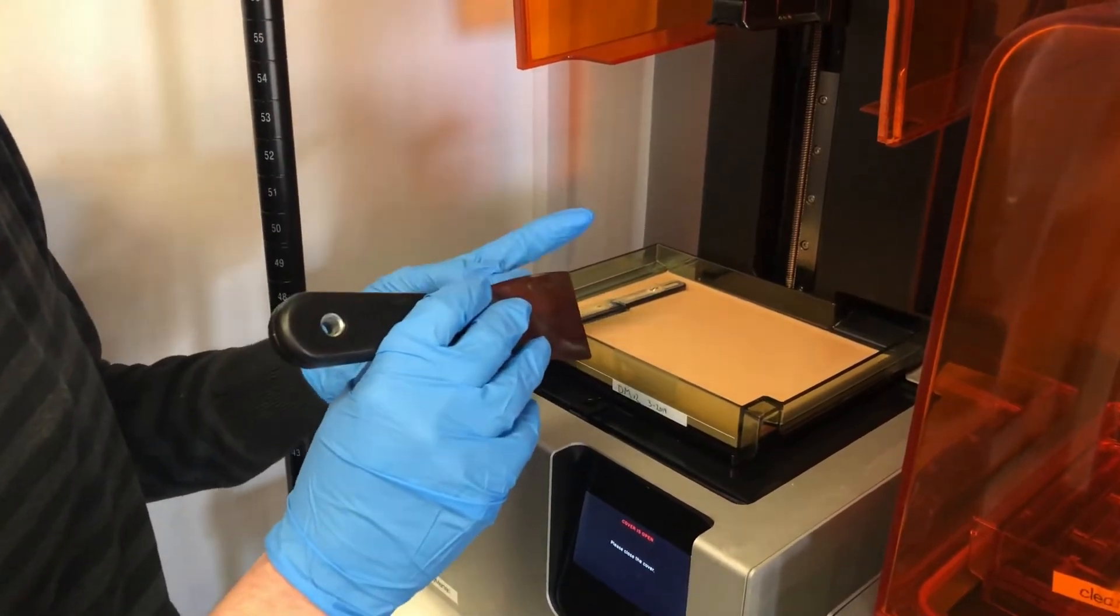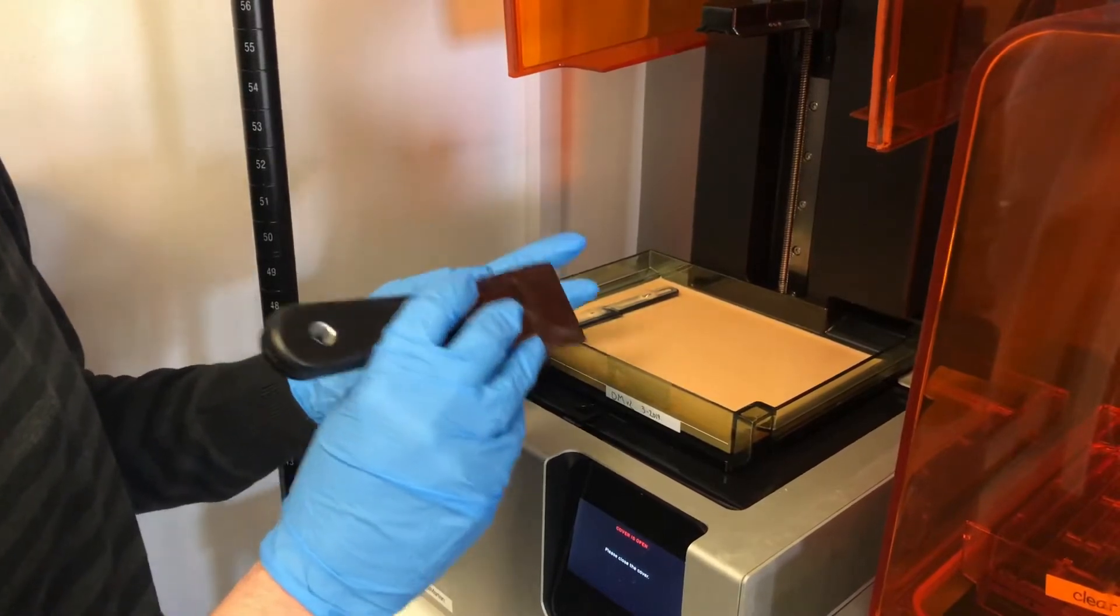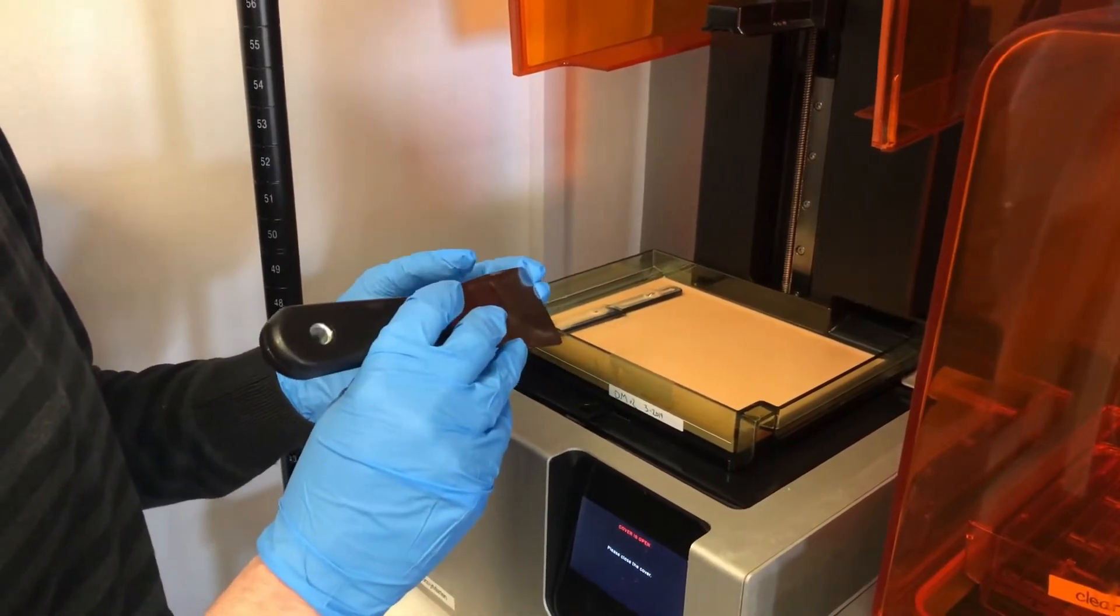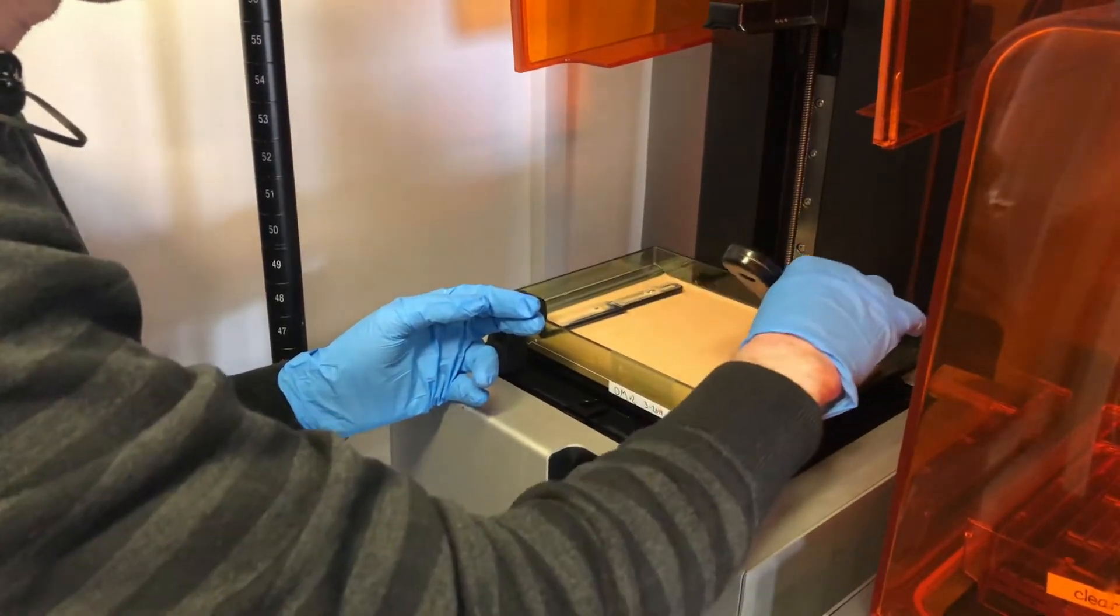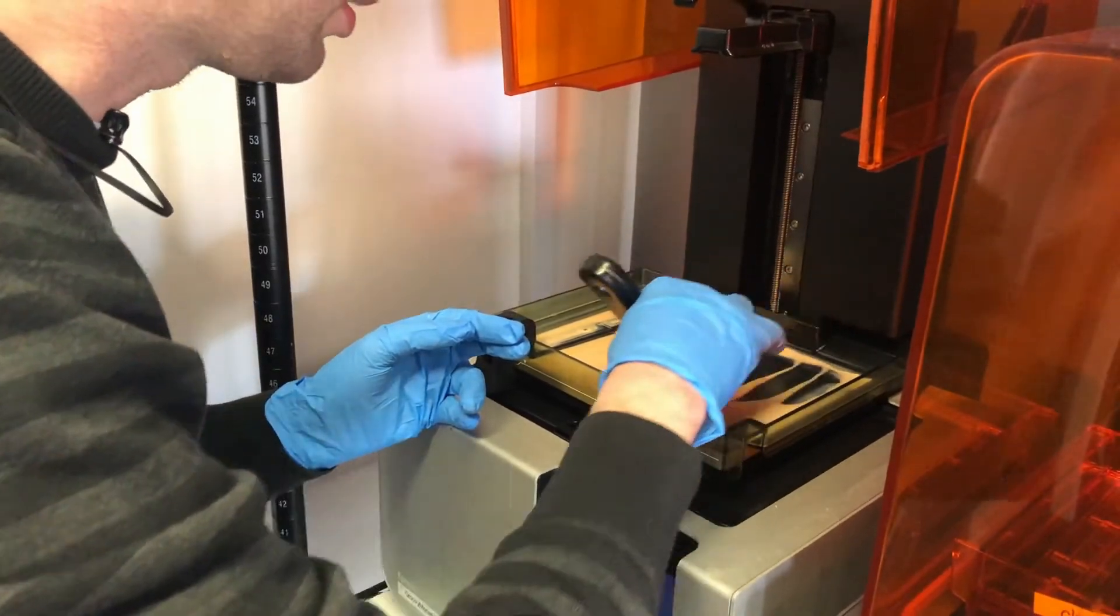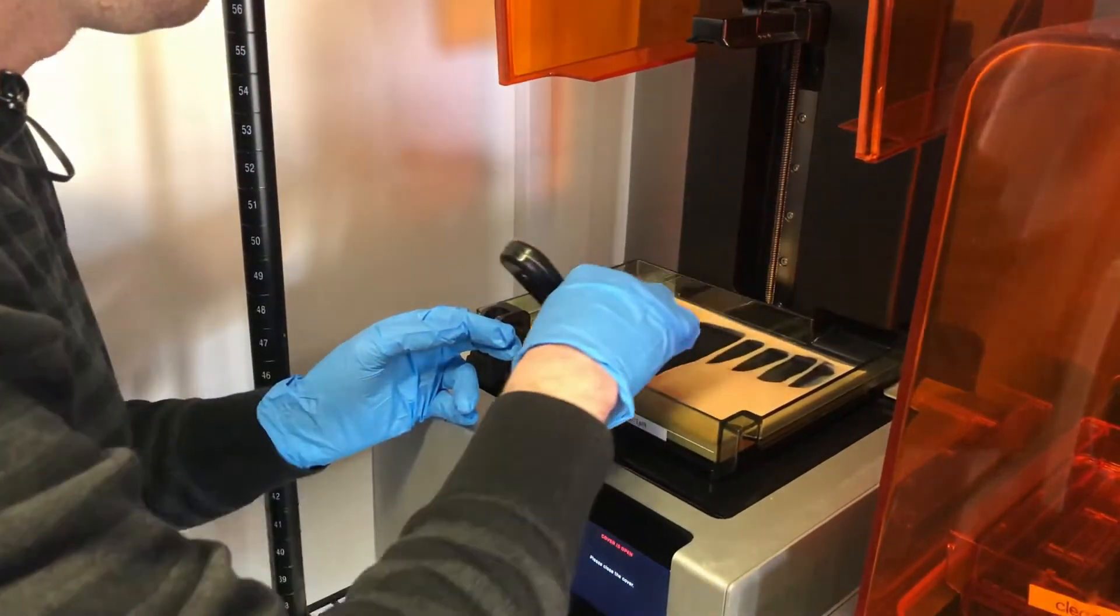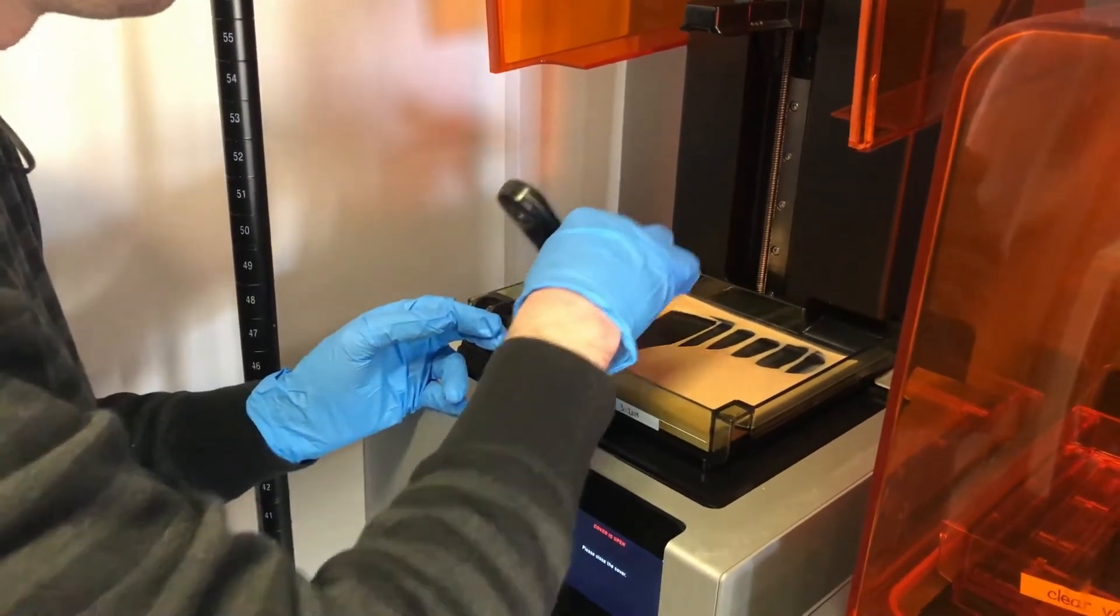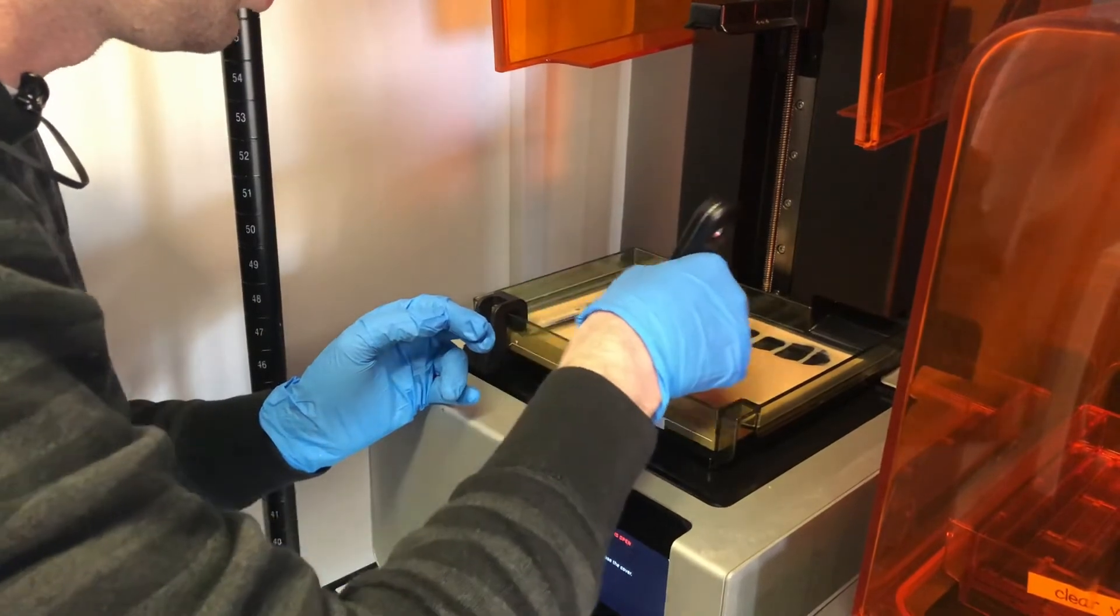What I'm about to do will do two things: one is it mixes the resin, and two is you can check the health of the resin tank itself. So I actually like a 45-degree angle scrape across the entire resin tank. As I'm doing that, I'm feeling for cuts, anything, any debris floating around. For example, this resin tank looks really good.